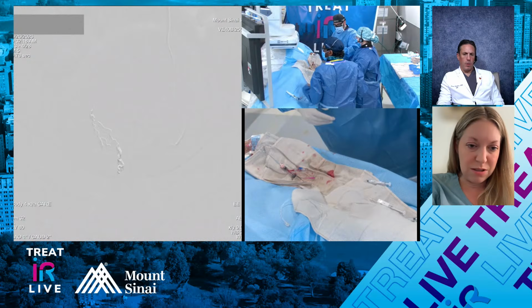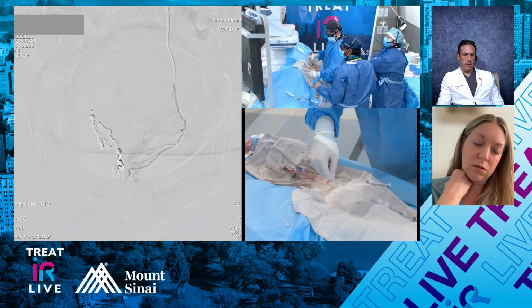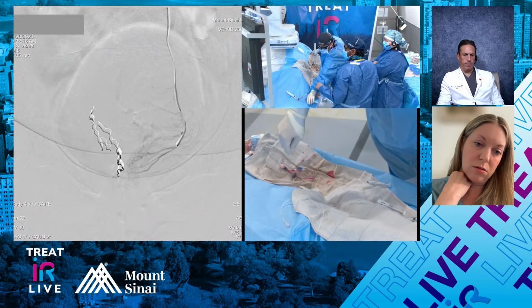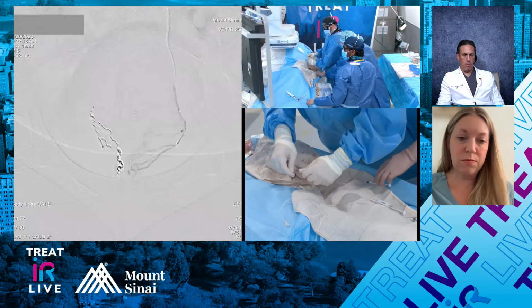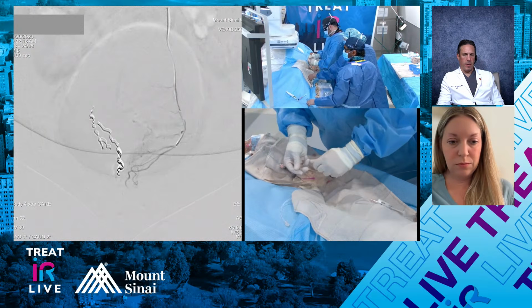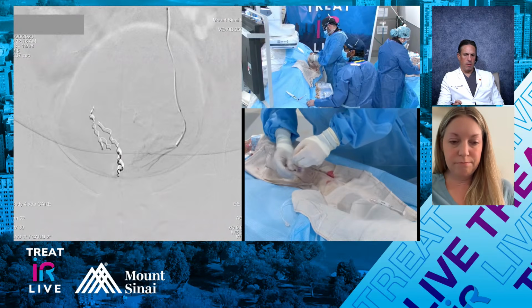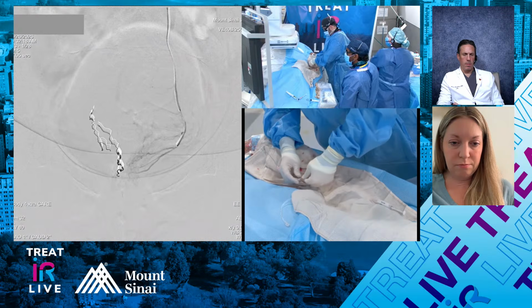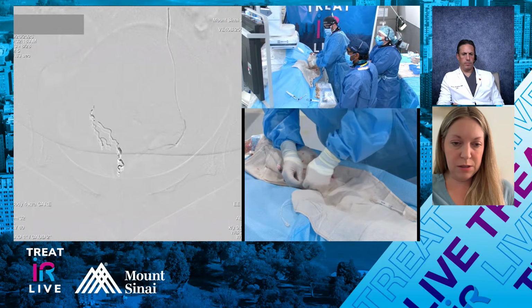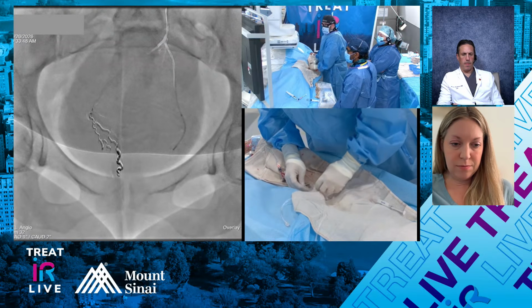This is looking nice. It looks like you guys are trying to navigate a little bit further past that small tiny branch there. Yeah, we're at a little trifurcation here. We're going to get into at least the bifurcation. It might be a great spot to treat both of those distal ones at the same time, is what I was thinking. Yeah, that's probably the plan, if the coils behave well, especially the soft one, you can get them to kind of pooch into both origins.